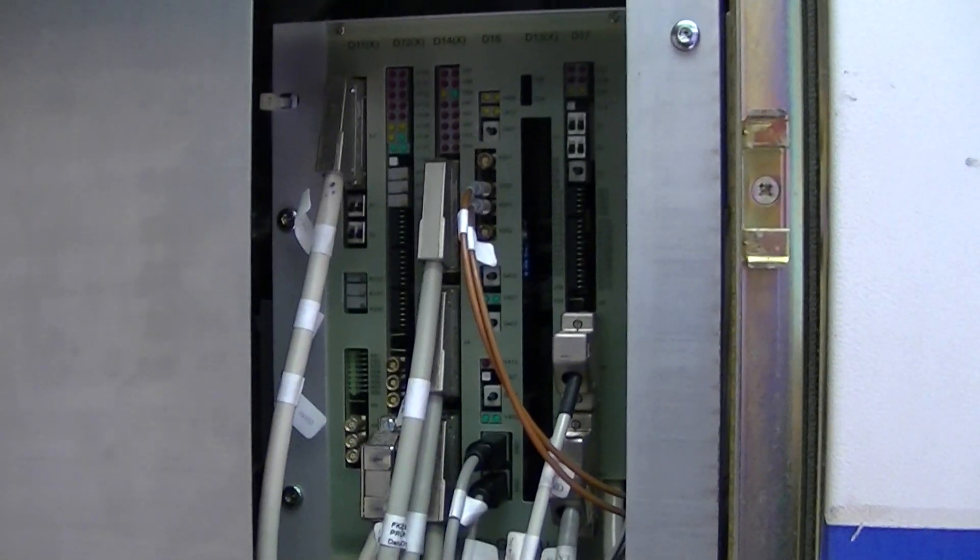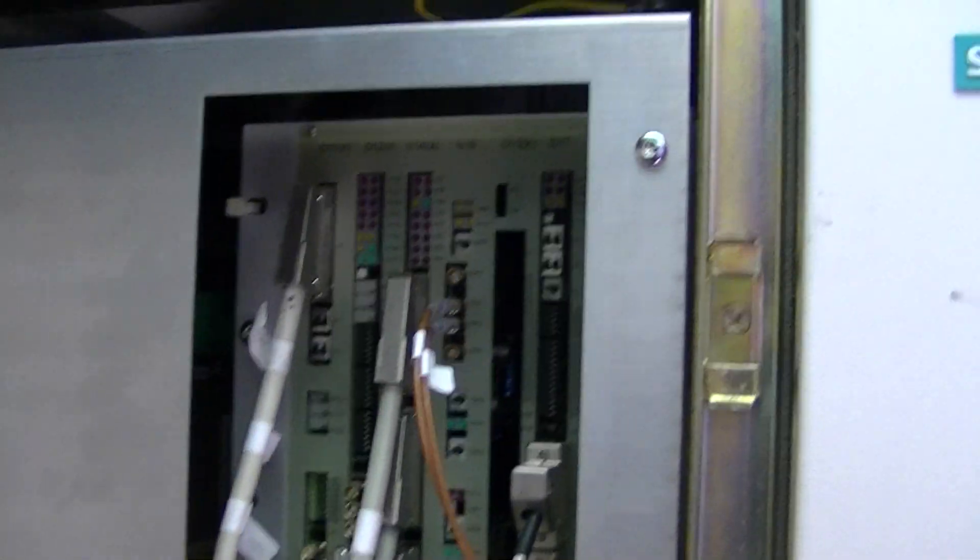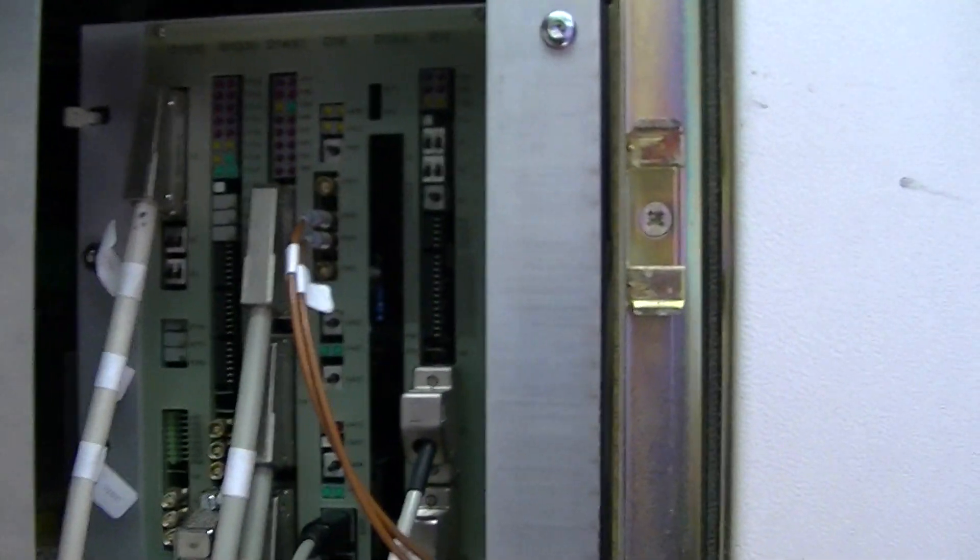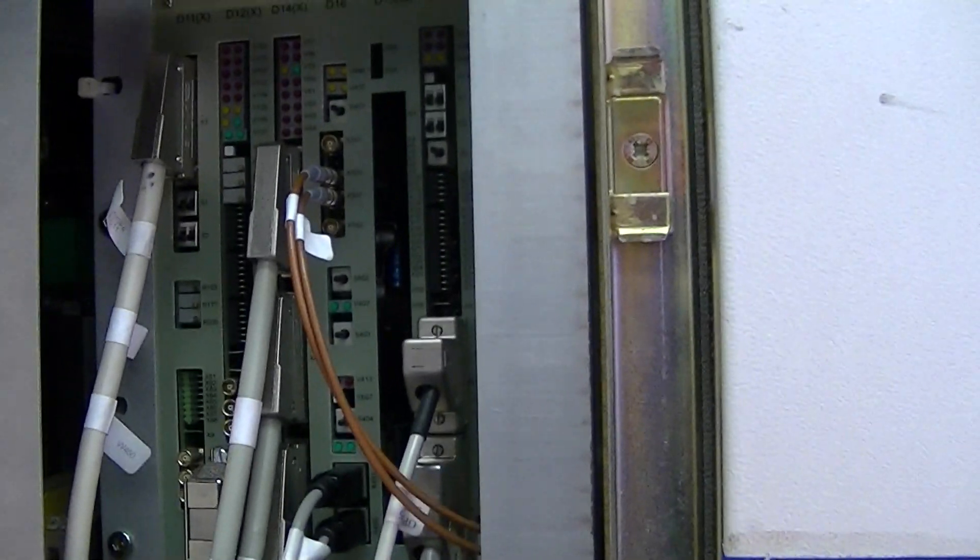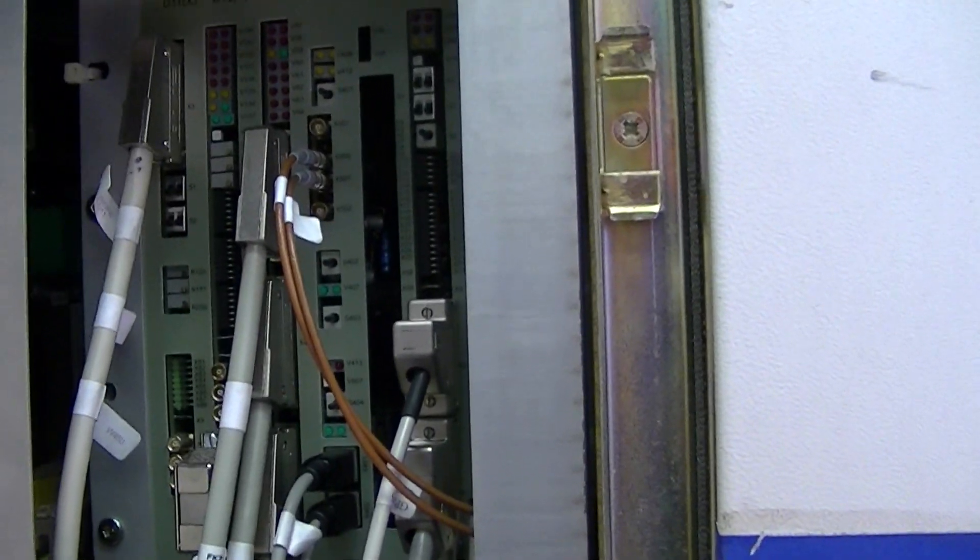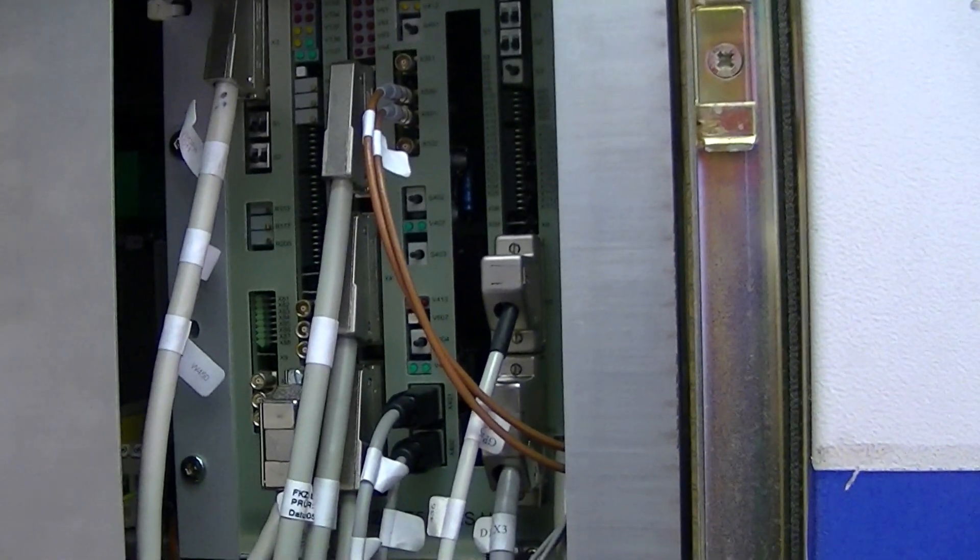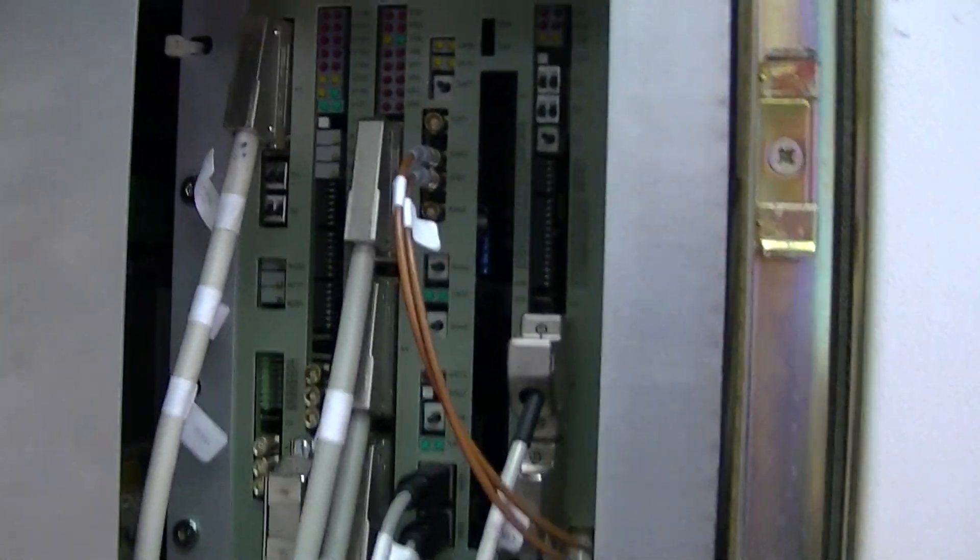You have the gradient small signal unit. This is what converts all of the information that comes from the host computer via the MPCU over to the controls to set up your scan parameters for gradient.